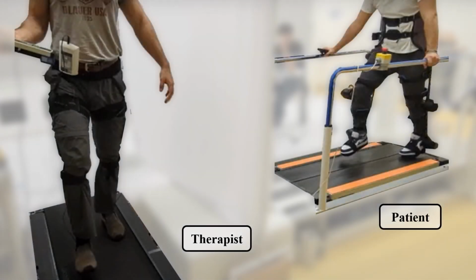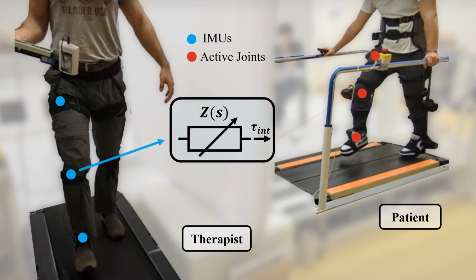In this work, we propose a framework for physical human-robot-human interaction during gait rehabilitation, where a physical therapist wears an IMU suit and a patient with sensory motor impairments wears an exoskeleton. To virtually connect the therapist and patient, we render a unidirectional interaction between the IMU and exoskeleton joint angles. The therapist can modify their own leg movements to apply corrections to the patient's movements without predefined exoskeleton trajectories.